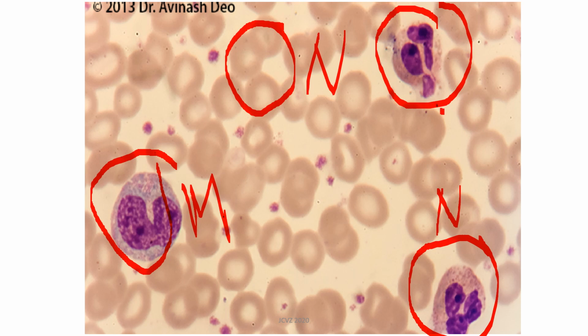Your red blood cells actually outnumber your platelets and your WBCs, because in the previous slides it has been mentioned that in one field you can see 200 to 250 RBCs, right? Okay, so these are your RBCs and you can easily identify them because of the presence of the central pallor, okay, due to the biconcave shape of your red blood cell.